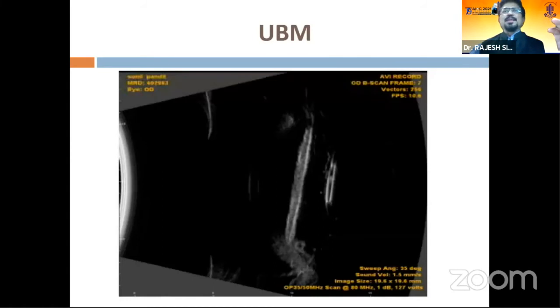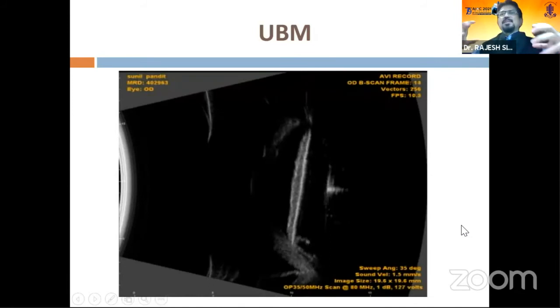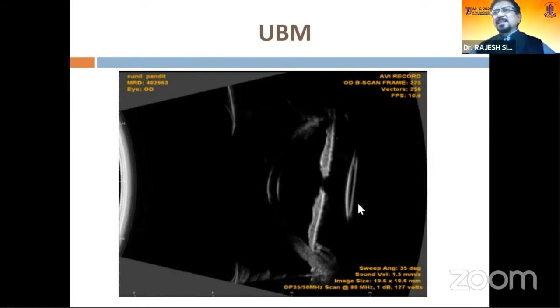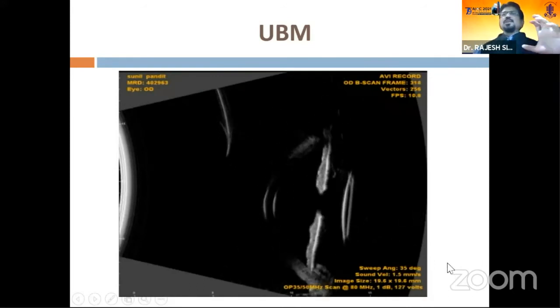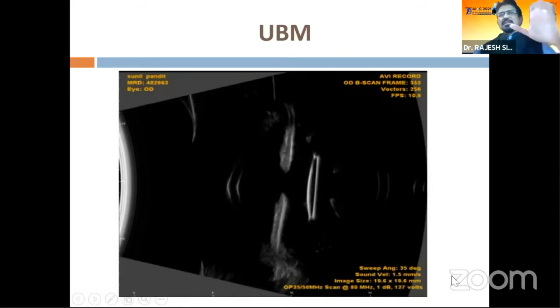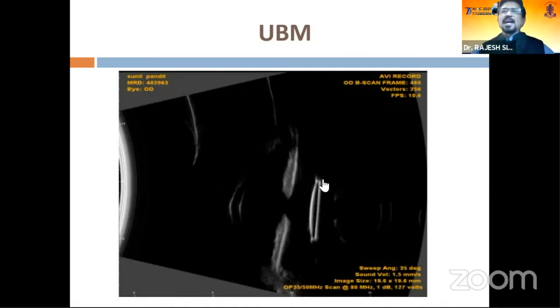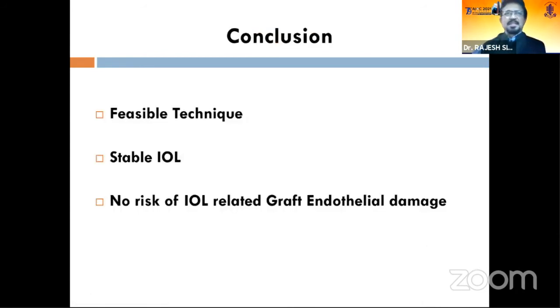And I just wanted to show you one thing: I have done the suture technique also. But when I did the suture technique, on UBM the lens was moving quite a lot. But here you can see the lens is absolutely sturdy. This is what Dr. Avnindra was telling, that the pseudophacodonesis is absolutely negligible when you do an intrascleral haptic fixation or the glued IOL technique. So this is what I wanted to show, by UBM, that the patient is moving the eye. You can see the section is changing, but the IOL is rock solid, sturdy in its position. So that is something which I wanted to emphasize.